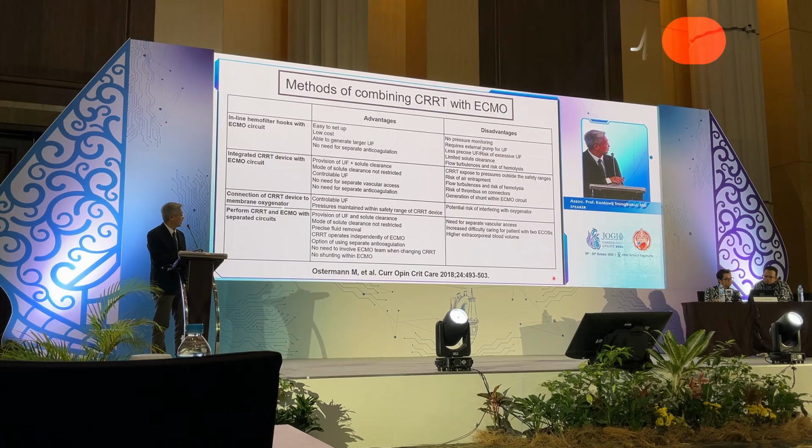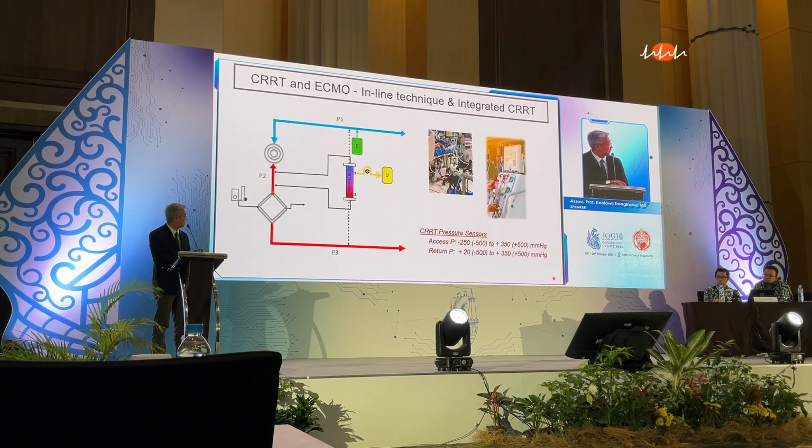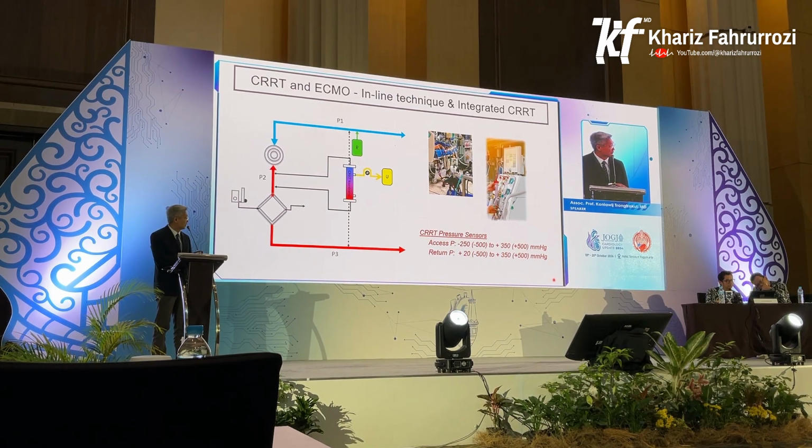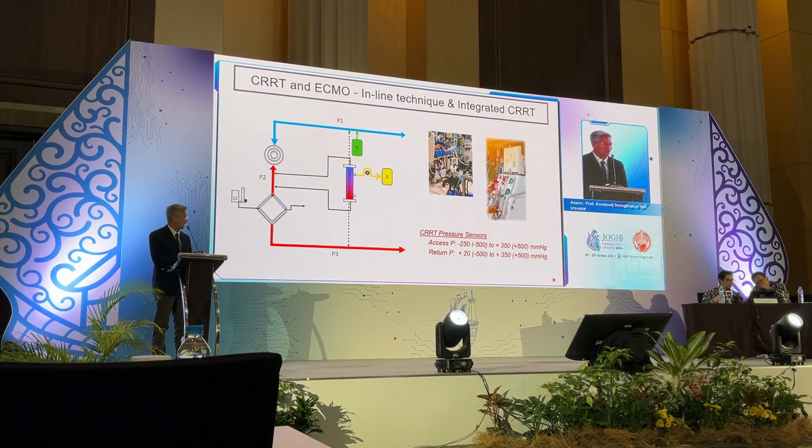Sorry, I have no time left, but I will show you an example that CRRT can be integrated into ECMO, especially, I think, it is recommended to connect CRRT into a segment of ECMO. You can use just the membrane or integrate the CRRT machine with the membrane as well. However, you need to check whether your CRRT can accept high pressure alarms or not. Please discuss with your distributor because ECMO pressure might cause a high pressure alarm if your CRRT is not updated to accept high pressure.